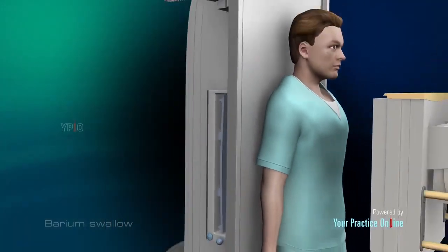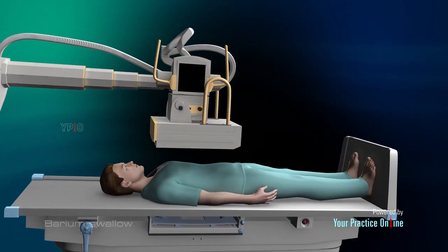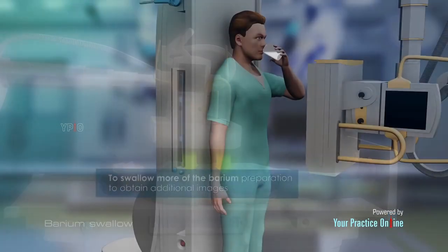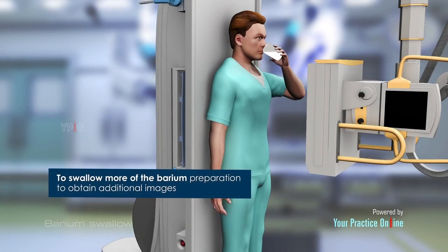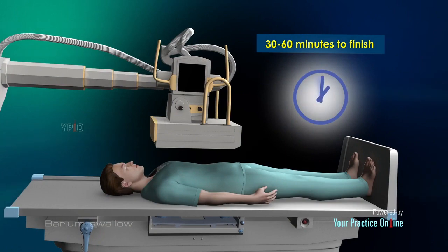The table will be tilted so that the barium spreads and x-rays can be captured at various angles. Your doctor may apply pressure to the abdomen to spread the barium inside. You will be asked to swallow more of the barium preparation to obtain additional images. The barium swallow procedure takes about 30 to 60 minutes to finish.